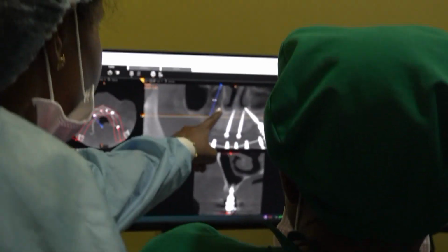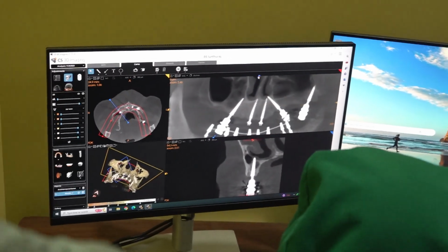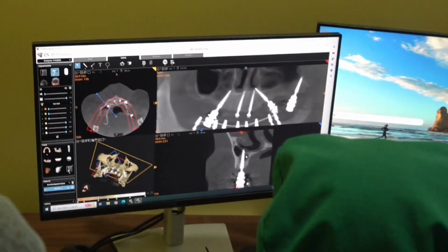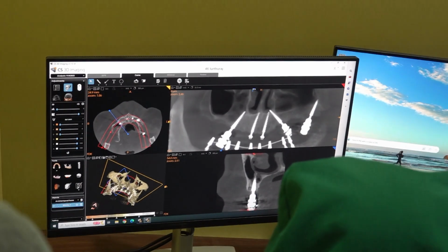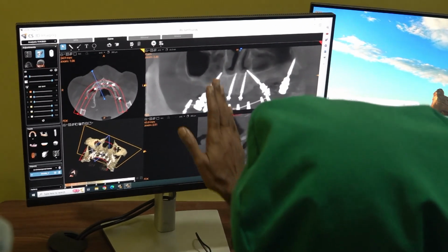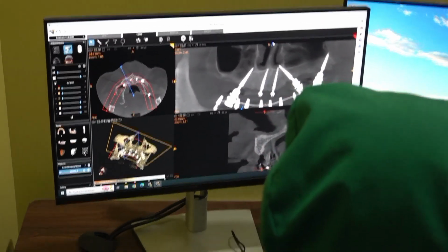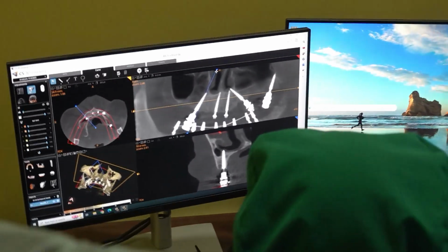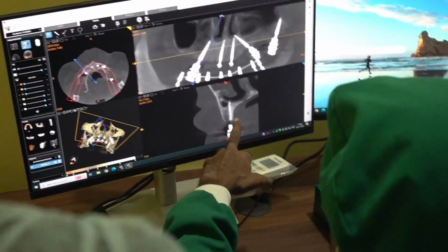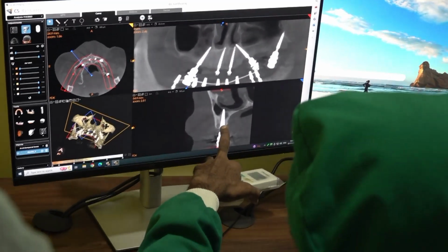The pterygoid, huh? Oh, this side. No, this is the last case. It is also somewhat trans-sinus, and so what we can do is, here we got a good bone. Actually we should have tilted a little more, but we didn't tilt it fully. Is it engaging the bone? Yes, it is engaging the bone. This is the mesial aspect of the implant. But the distal part is partly in the sinus, but the tip is.